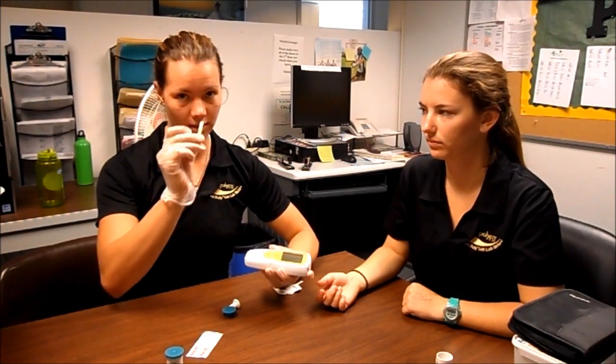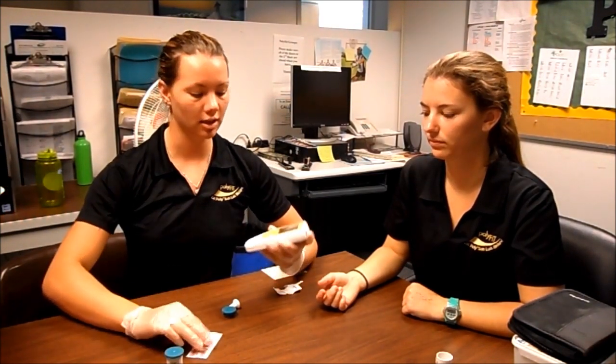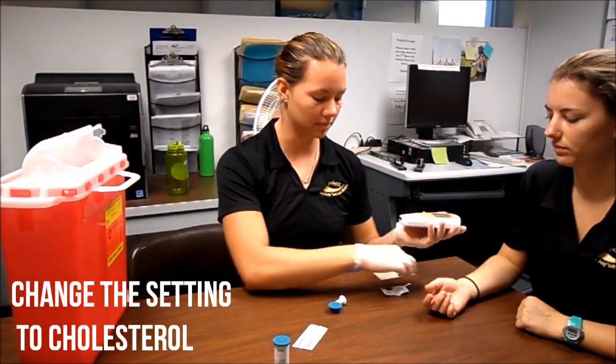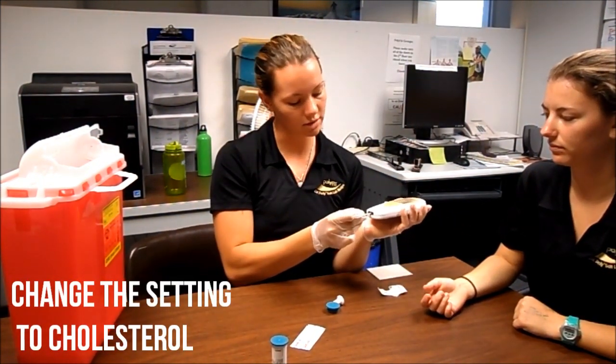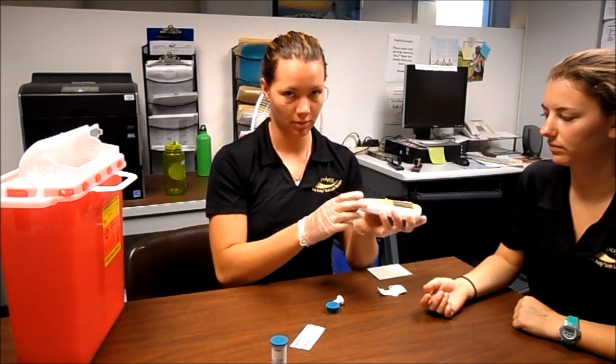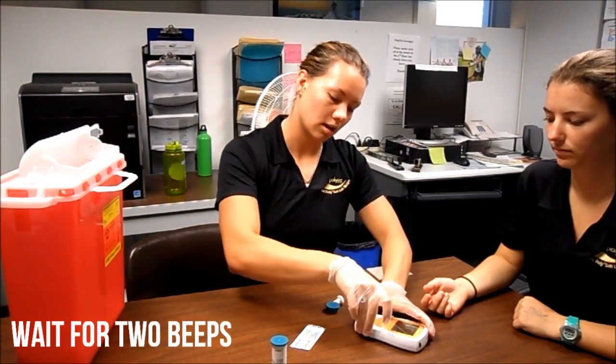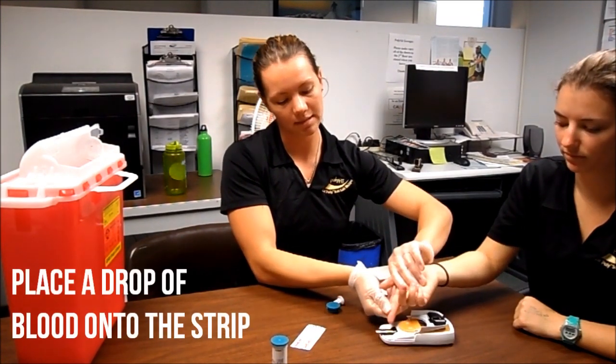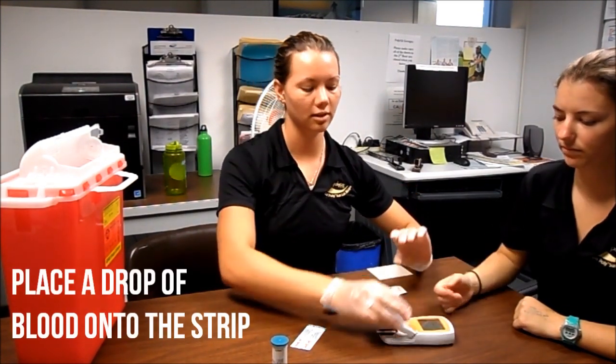After taking your strip out and discarding it in your sharps container, press the set button on the side of the machine to switch to cholesterol. Insert a cholesterol strip and wait for the two beeps. Open up the machine, milk the finger again, place the blood on the strip, and close the machine.